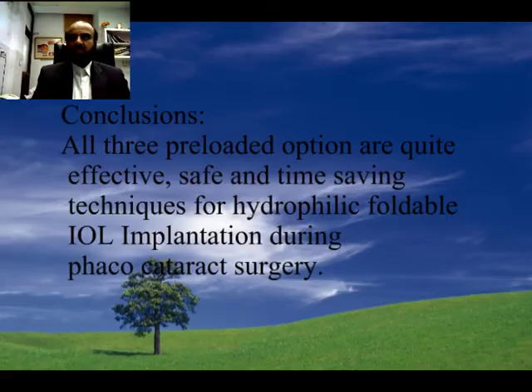In conclusion, all three preloaded IOL options are quite effective, safe, and time-saving techniques for hydrophilic foldable IOL implantation during phaco surgery. Especially the technique observed in the last two clips — the Chroma Quadrix four-haptic IOL — comes truly preloaded and makes the life of the surgeon very easy. The IOL doesn't need any handling and it saves time as well.